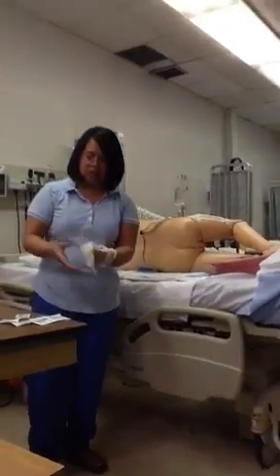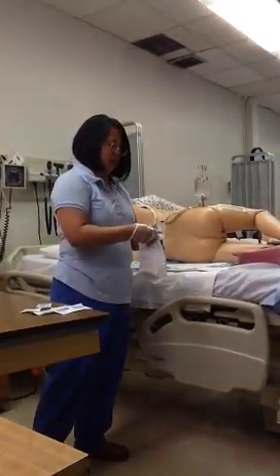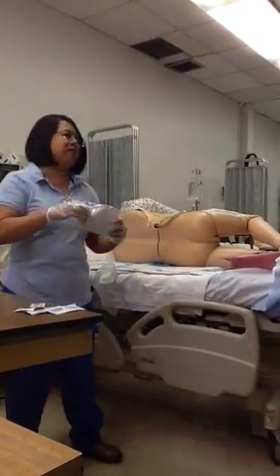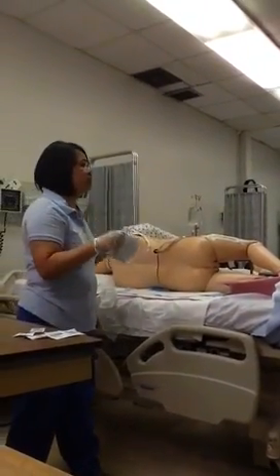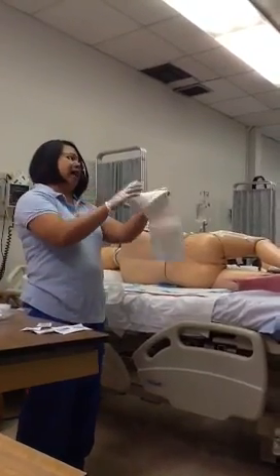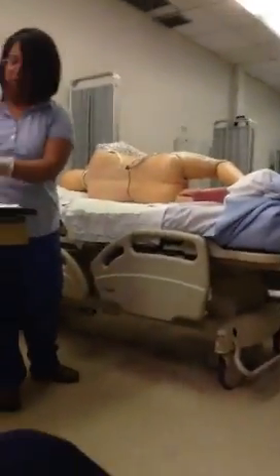The first thing I'm going to do is fill up my bag with as much water as the doctor has ordered. So this cleansing enema bag you get out of the supply closet, okay? You get it out. There are different kinds. I highly doubt this exact kind is going to be at your facility, all right? But it will always say cleansing enema bag kit on there. So you get that out. There is actually a pad here. If you don't have a blue chuck, you can always use this pad, okay? It doesn't matter. All right, so then here's the bag right here.